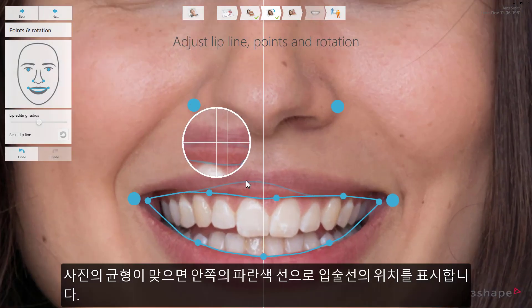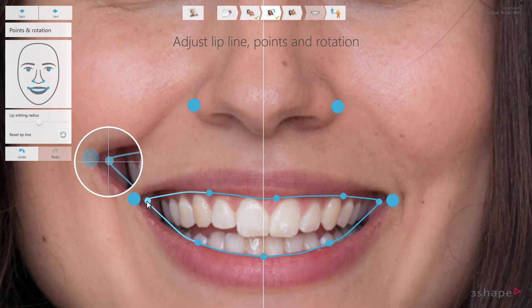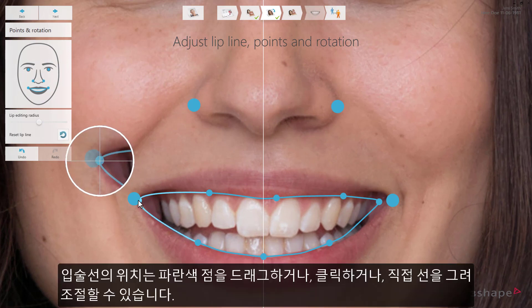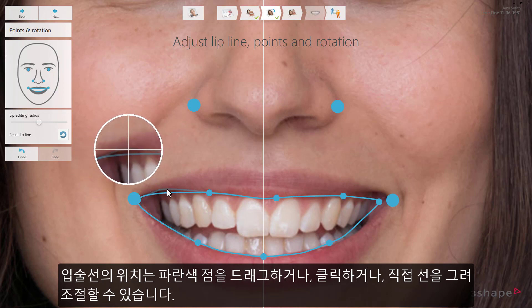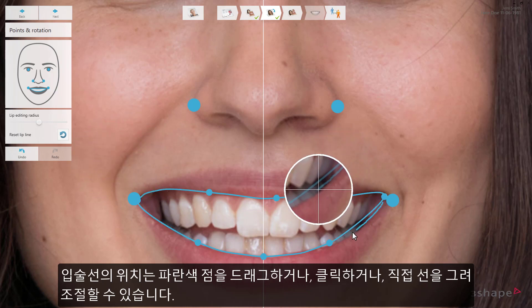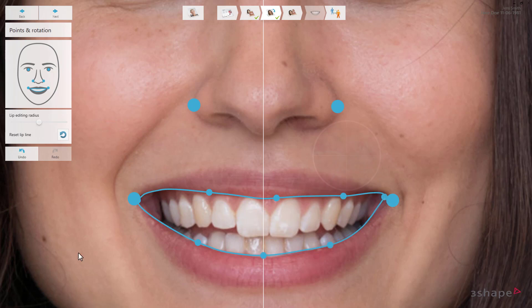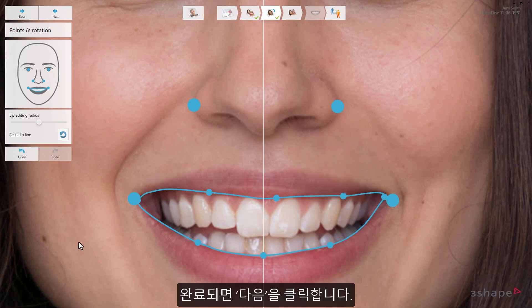When the photo is balanced, adjust the placement of the blue inner lip line, if needed. This can be done by dragging the control points, pressing the points on the picture, or by drawing a line on the picture. When ready, press Next.